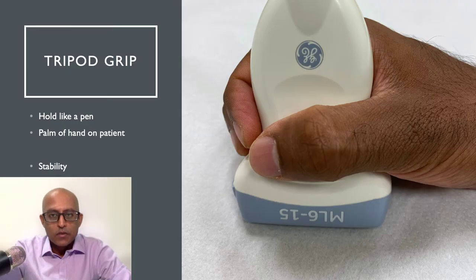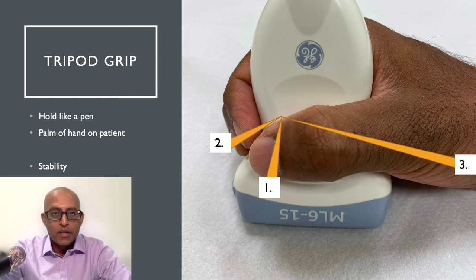What I suggest is to consider using what I call the tripod grip when holding the transducer. Much like you might hold a pen, you grip the transducer and place the base of your hand on the patient. This confers a lot of stability and it also allows you to follow the patient's anatomy as you're doing your imaging. It's much like holding a tripod and there are three points of contact — two on the transducer itself and one on the patient.